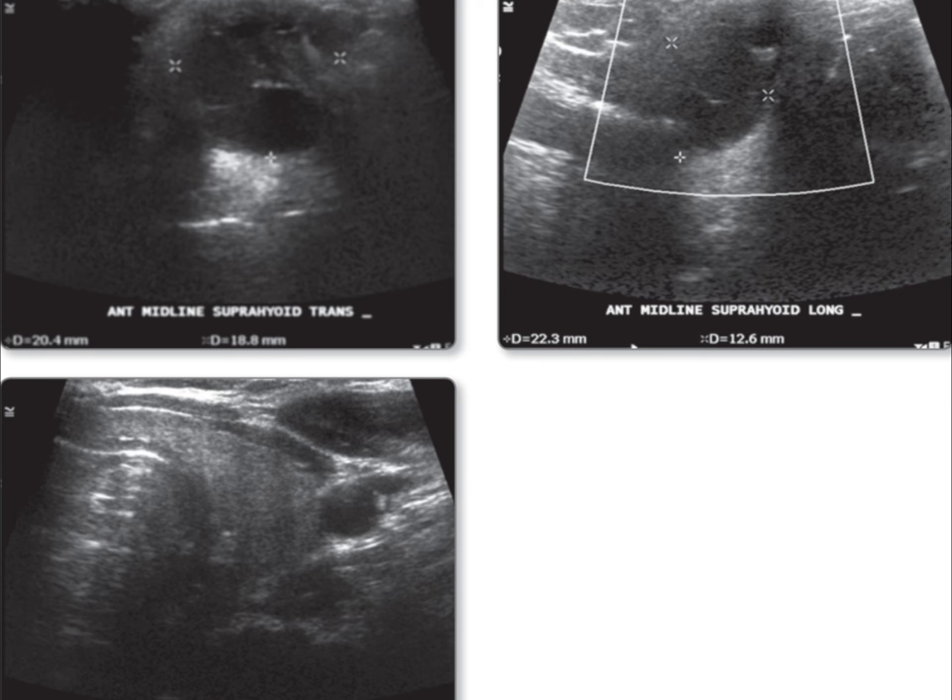Welcome to Radiology Made Easy. Today, we are reviewing selected ultrasound images of the neck, focusing on an abnormality observed in the anterior midline of the suprahyoid region.